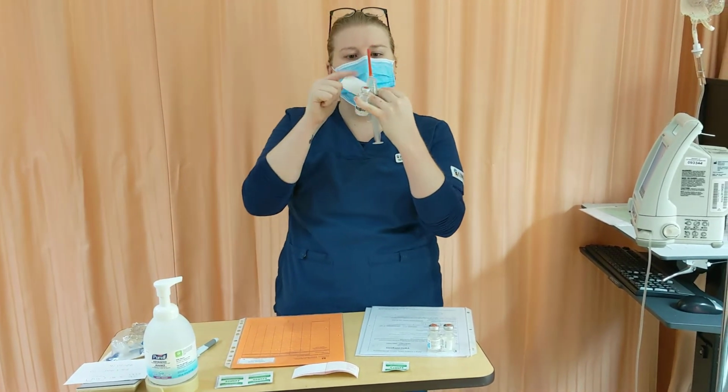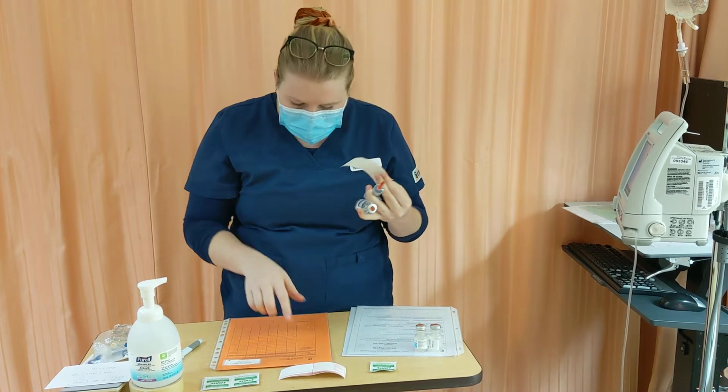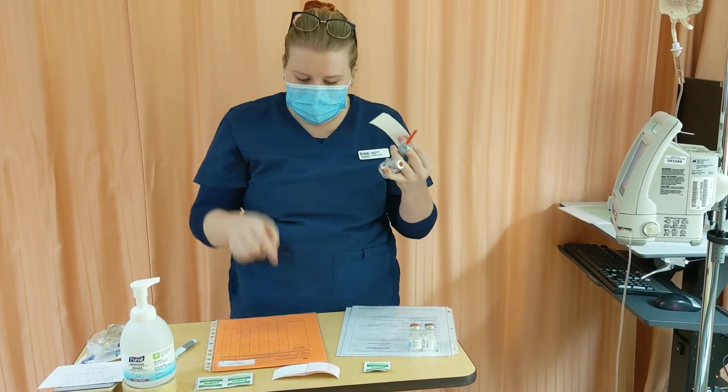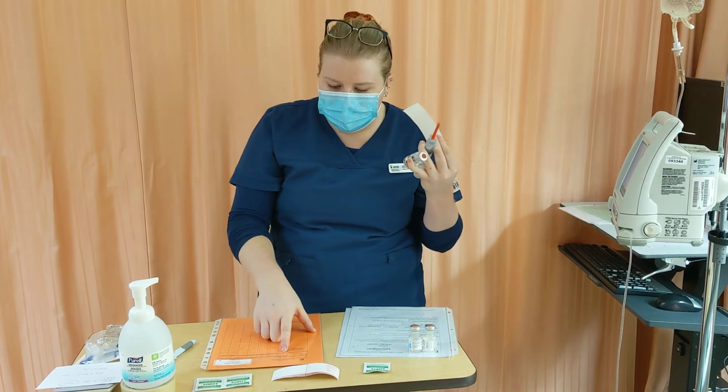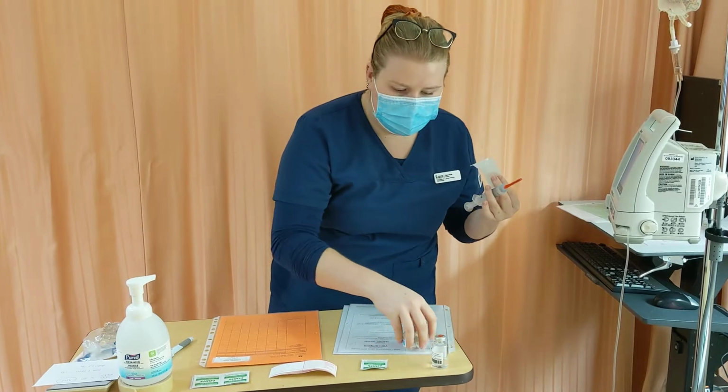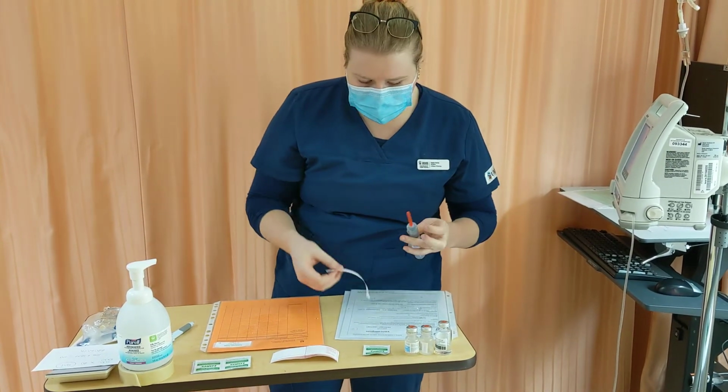I have 10 ml in here with no bubbles, so that's correct, and on here I also have 10 ml. It's IV, this can be given IV, this is going to go in an IV piggyback, and this is going to attach to the IV piggyback. It's written Q12H, written here twice, one of those times is now, so I can go ahead and give this right now. I can put these back and grab my right mini bag.